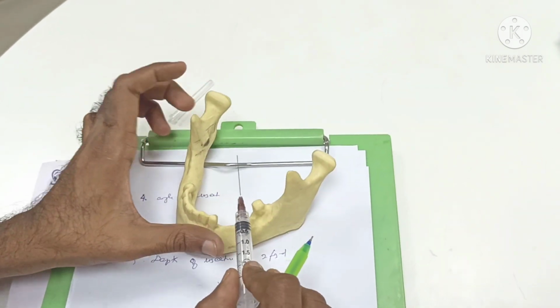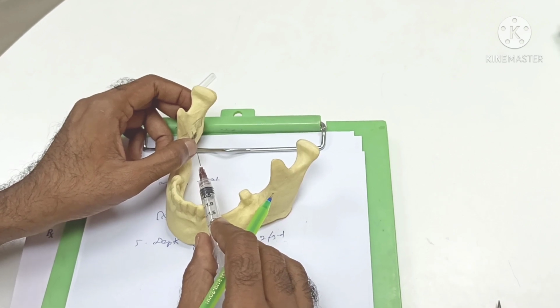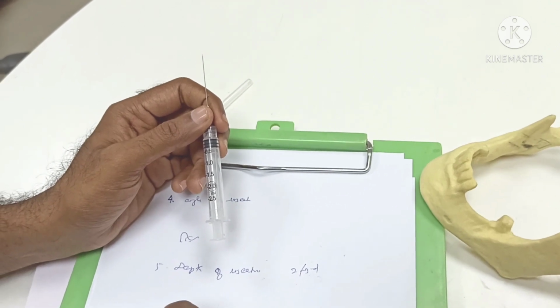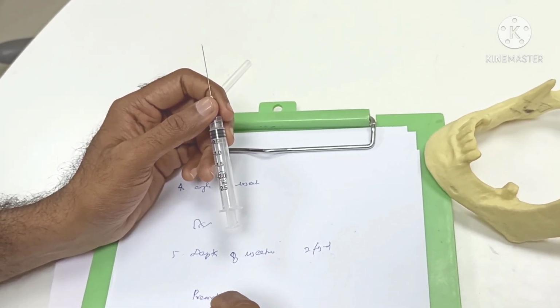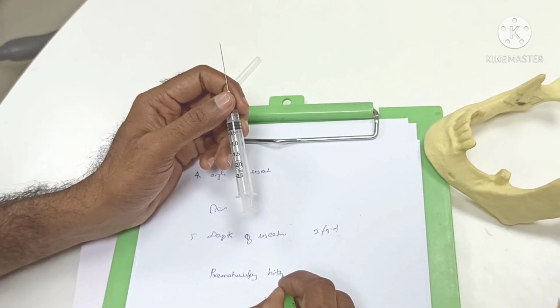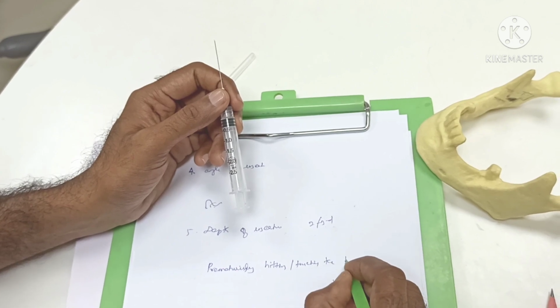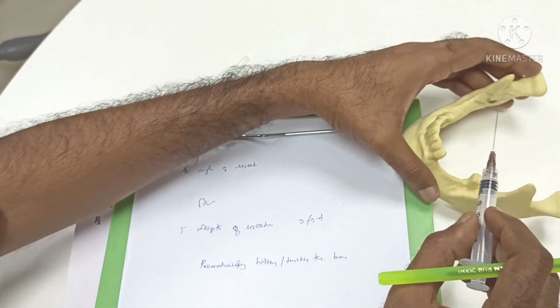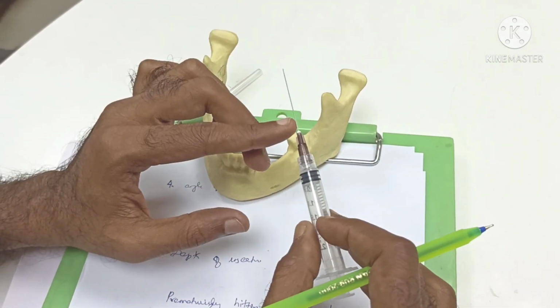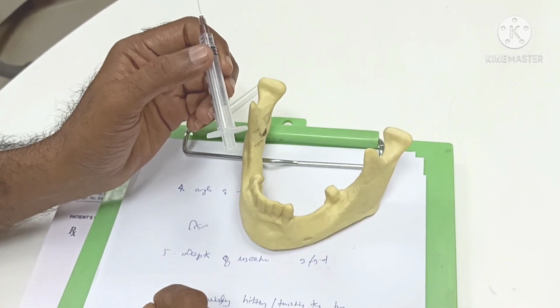The difficulty arises when you are hitting the bone before you reach enough depth, prematurely hitting or touching the bone. If the needle touches the bone prematurely, before it achieves 2/3 of the depth, what to do? This is the main thing.